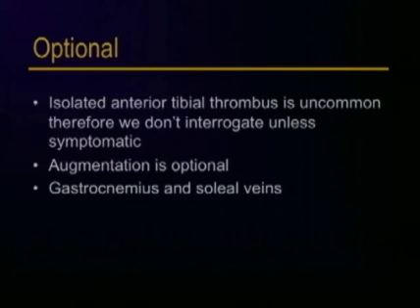We don't normally image the anterior tibial veins unless the patient is symptomatic in this area. Augmentation is optional and can be used to answer questions or when the examination is unclear. And the gastrocnemius and soleal veins may also be evaluated if those areas are symptomatic.